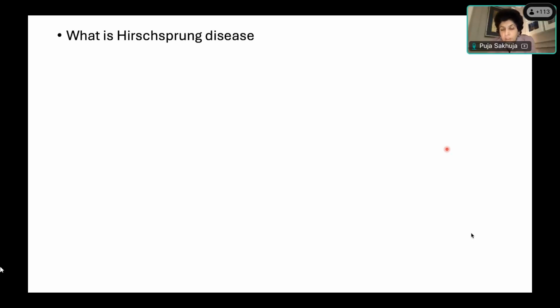Okay. What stains can we do for the ganglion cells? Special stains? Ma'am, acetylcholinesterase and calretinin. Acetylcholinesterase is done on what sort of section? Frozen section, right? Yes, whereas calretinin can be done in the routine paraffin-embedded sections.